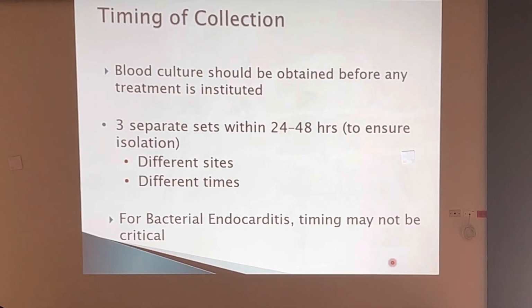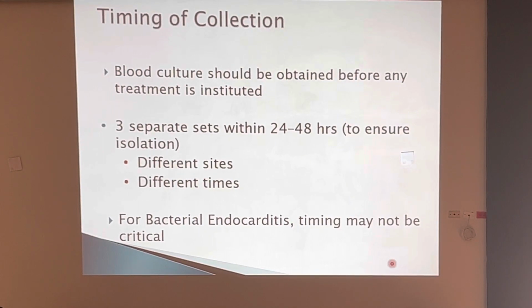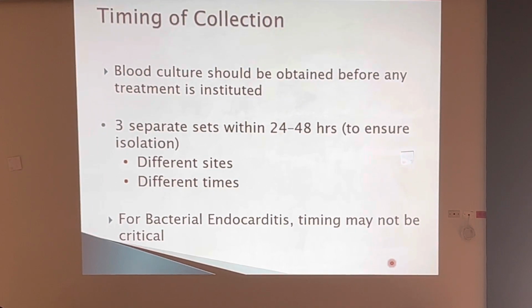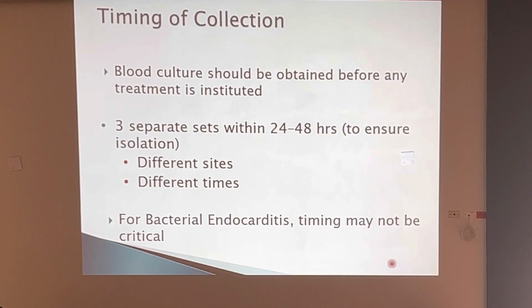And of course, you want to collect your sample before you initiate treatment. If you initiate treatment before collecting your sample, you're giving them antibiotics. These antibiotics might well be effective against the organism, pretty much kill it, so that when we do the test, we're not able to detect anything, or it becomes more difficult to detect it. In addition to that, you see here 3 separate sets, and you're going to be timing them over a period of 24 to 48 hours.